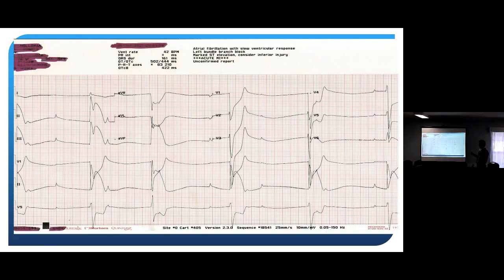Yeah. No, we just take care of it. But yeah. So my point to that is 12 leads are a screening tool. They can pick up things like hyperkalemia. They can pick up STEMIs. But a normal EKG does not mean you're not having something really bad happening to you. So yes, people can show up at the fire station, they can get a 12 lead, want a vital signs check, and then want to go home. That's fine. I would recommend to them, if they have health problems, hey, you probably ought to go to the hospital. You can go by your private car. I don't have to take you, right? All the time. All right.